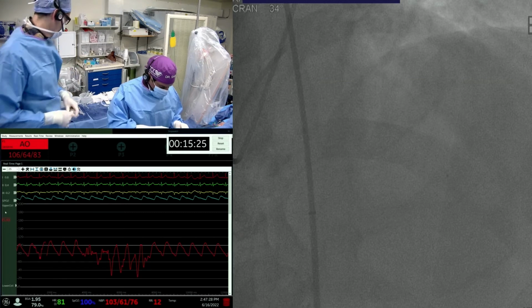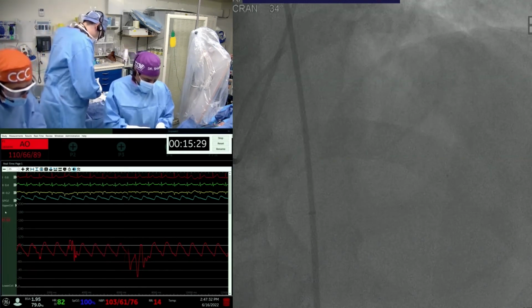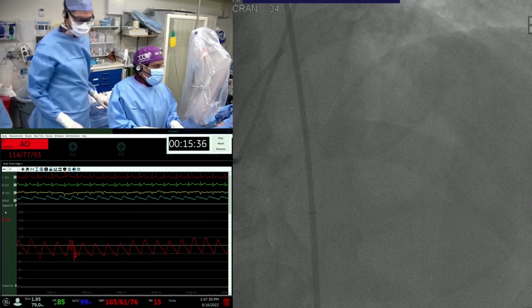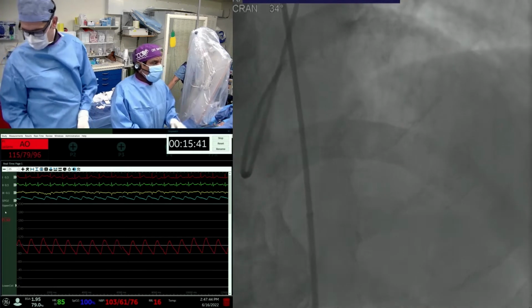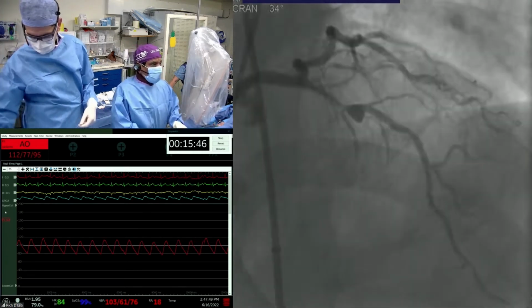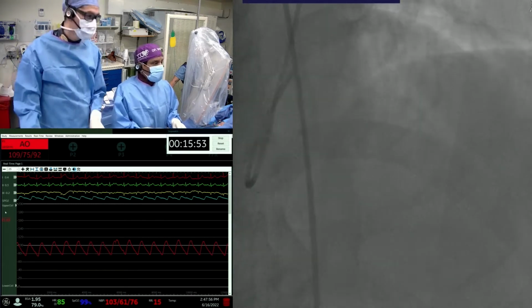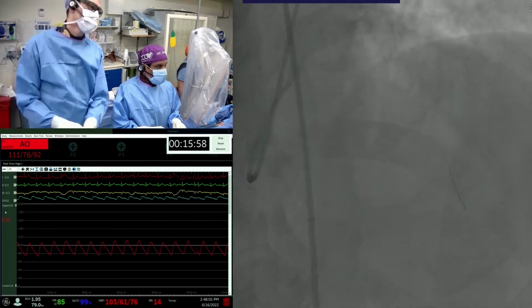Okay, you can have a discussion that in this tight lesion, will somebody think about doing this case with IVL? But the lesion is 90+% proximally, whether IVL will even go needs to be seen. Yes, we saw that. Yeah, there's a combination of calcific lesion with aneurysm. Has anyone any comments or reservations about this case? Maybe Dr. Waxman.